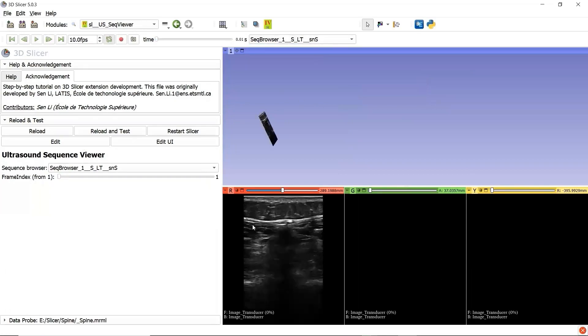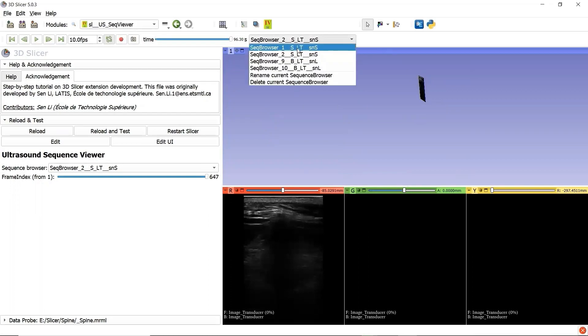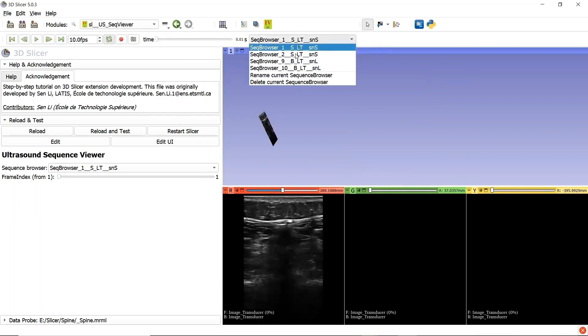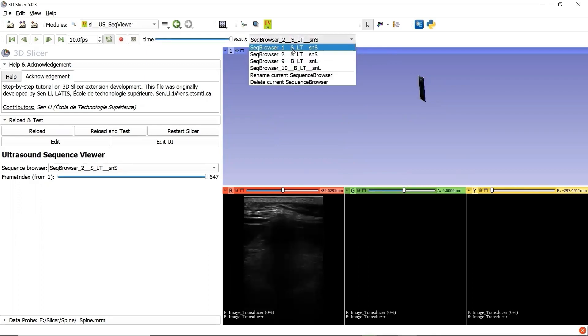not only two viewers are synchronized, but also the ultrasound image can update as we change the active Sequence Browser node from the sequence viewer given by 3D slicer. We fixed the bug.